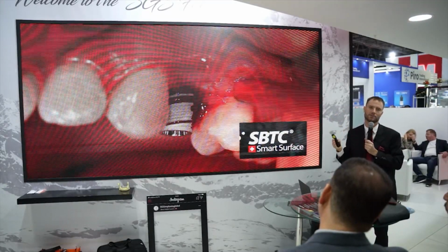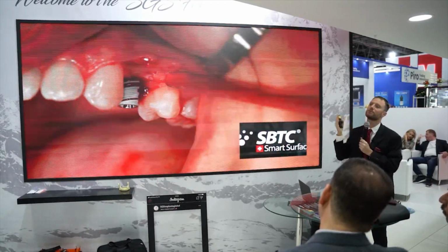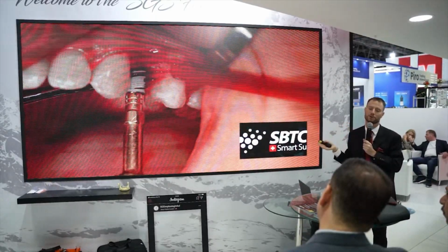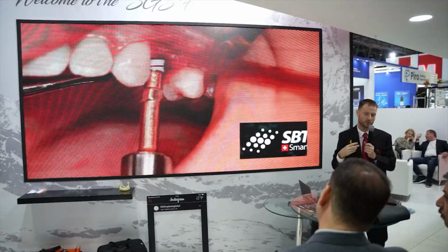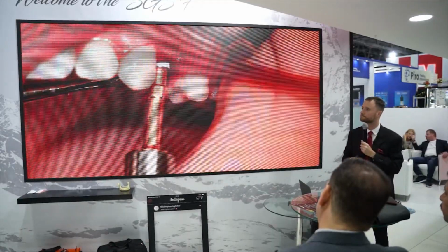Comparing, I see a lot of implants here in the market now. We have different types. We have implants with small threads and we have implants with big threads. It is a different way how to do that. It's like driving a car, automatic or gear drive, total different way. You cannot use the same protocol for these types of implants as you were using for, let's say, a Camlog implants. So it's always important to consider this aspect when you do that.